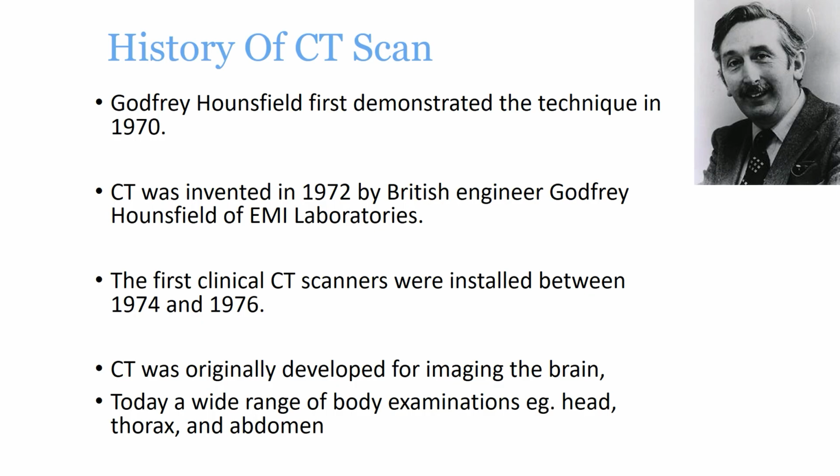Let's discuss the history of the CT scan. The CT scan was discovered by Godfrey Hounsfield in the 1970s.